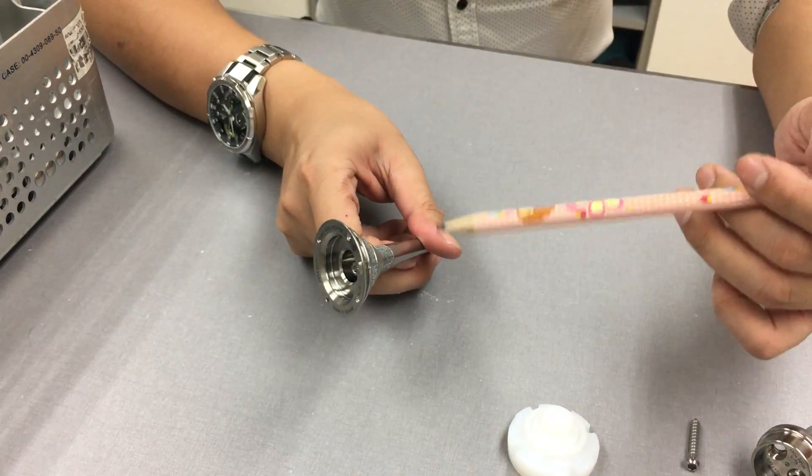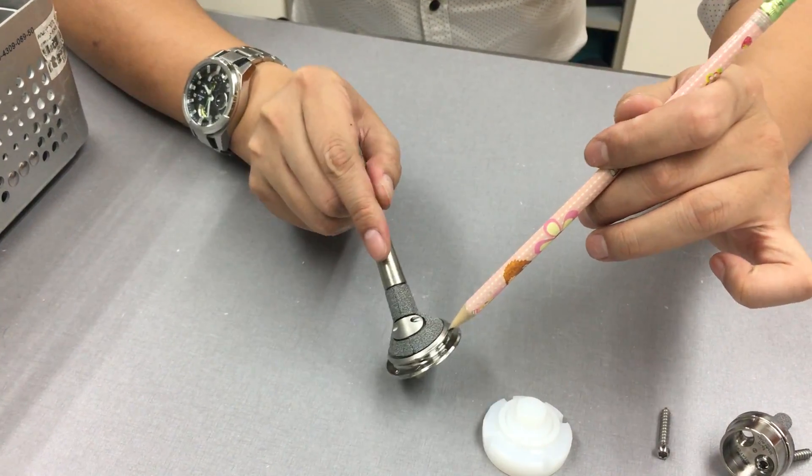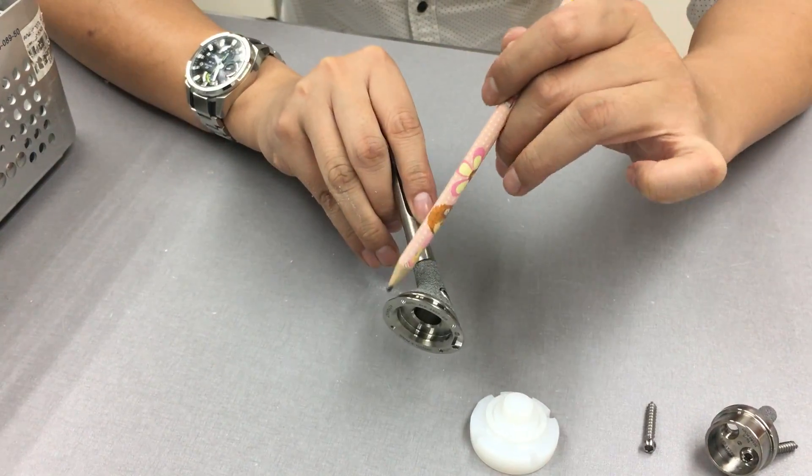This is your TM reverse stem, your TM humerus stem. You have two lateral holes and you have five proximal holes around this.